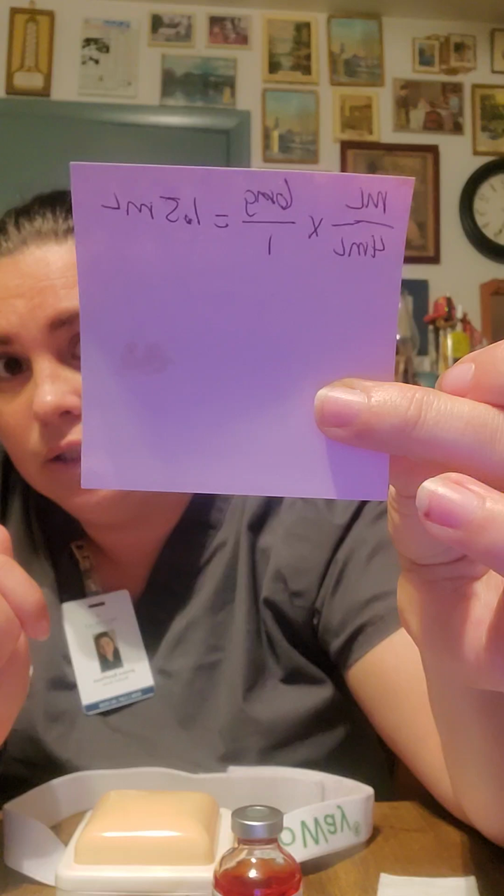So first I would begin with verifying the 6 rights: right patient, right drug, right dose, right route, right time, and right documentation. Once I've done that, I will check the MAR. In my MAR, it has 6 milligrams over 4 mLs of morphine, which when I did my calculation comes out to 1.5 milliliters. Okay, so once that is confirmed, I would gather my supplies.